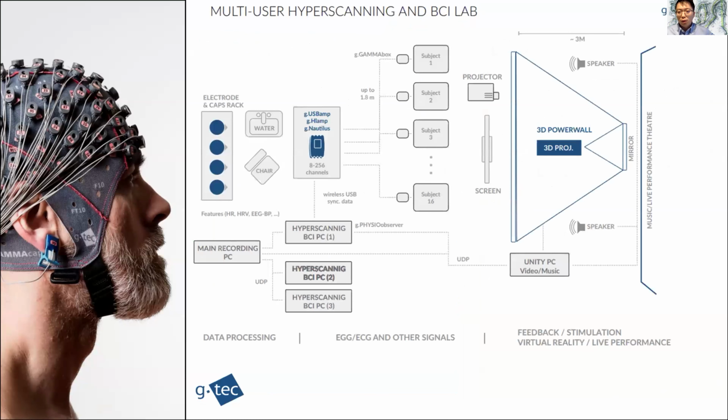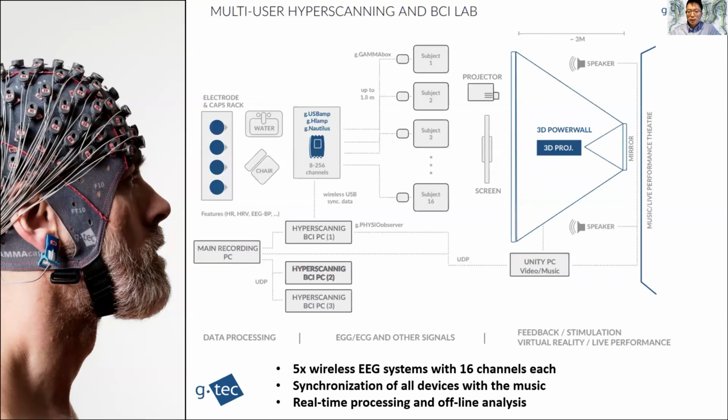For the second example, I want to explore something truly remarkable: a hyperscanning lab studying the neuroscience of a musical ensemble performance. So let's picture this. Say there are five musicians in an ensemble: one conductor, one pianist, two violinists, and a cellist. They are performing a Mozart piece, and we want to simultaneously record their brain activity to investigate the synchronization between them.